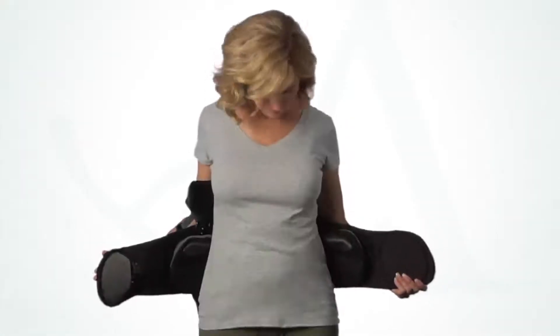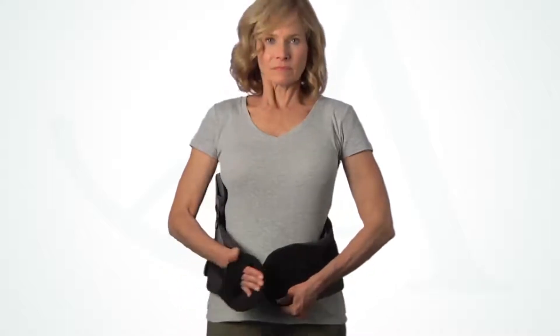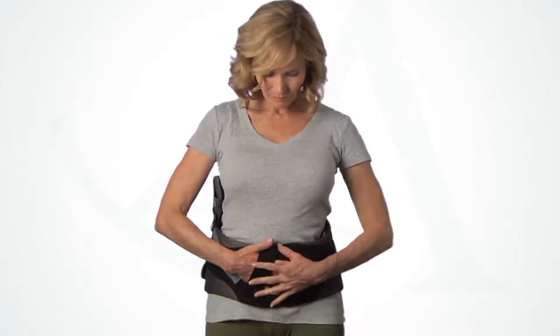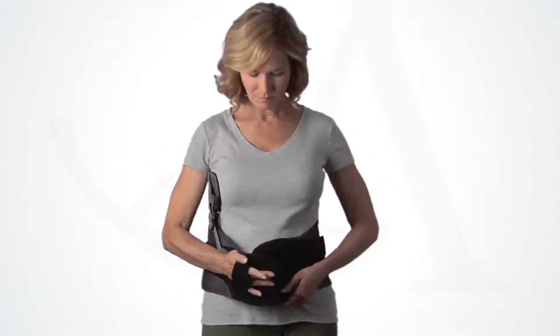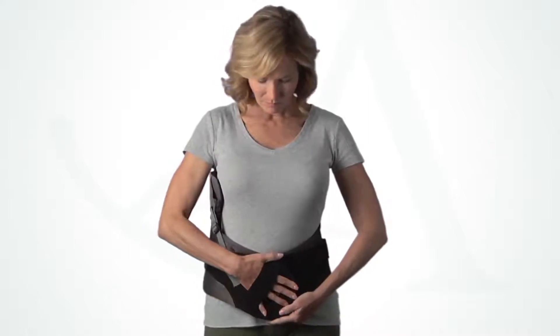Have the patient apply the brace, ensuring they understand the importance of reapplying it in the same position each time. Have them inhale deeply and wrap the belt around as tight as possible, then press down firmly to secure. Before tightening, be sure both the top and bottom of the belt are snug. If needed, angle the ends of the brace to achieve a snug fit at both the top and the bottom.